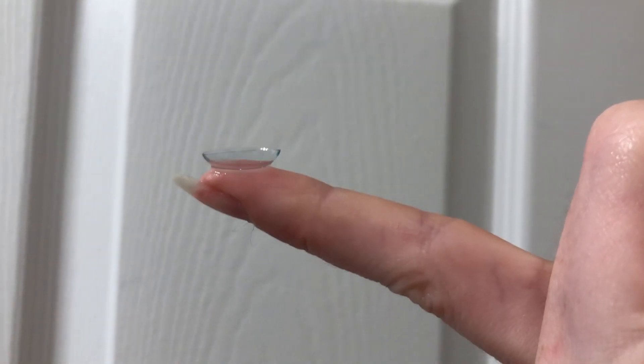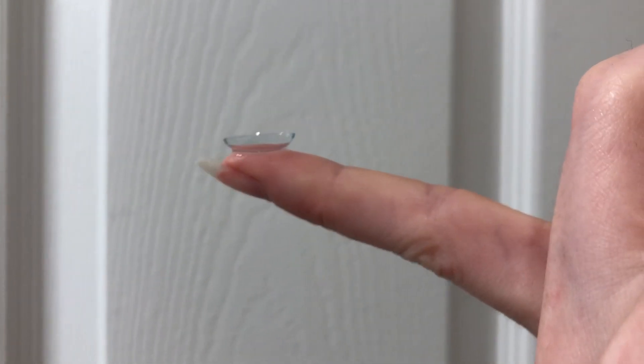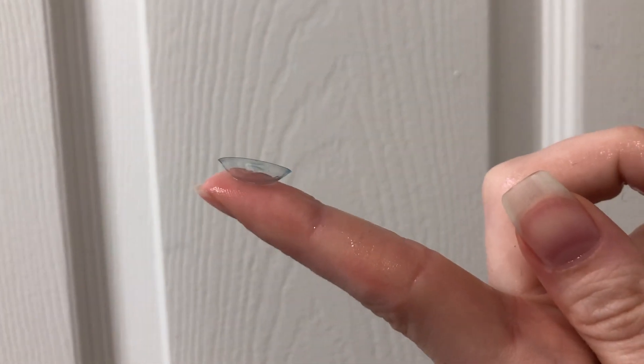I'm going to show you the difference between how it's supposed to go on versus if it's inside out. If you're not sure, just turn it the other way and you'll know. If it's the right way, it curves up and looks normal. If it's inside out, it flares out to the side. I've heard that if you put it in inside out, you'll just know, and I don't want to waste a contact, so make sure you put it in the right way.